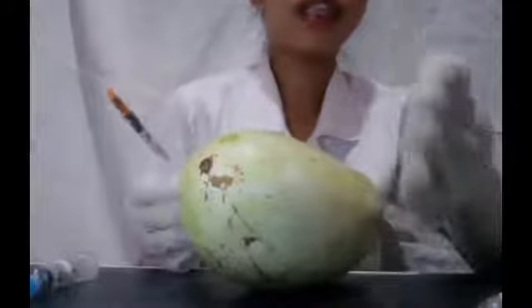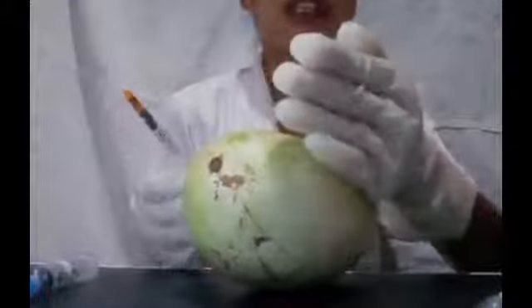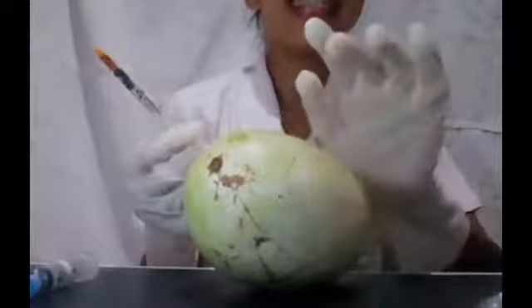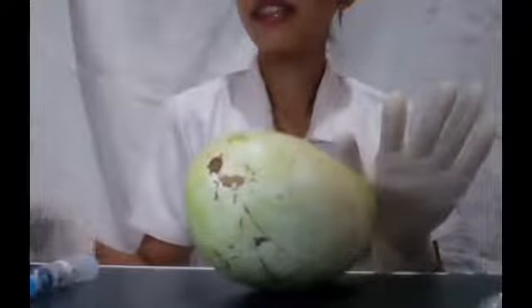So we're going to use our hand to move the skin, while the other hand holds the needle. This is our intramuscular injection.